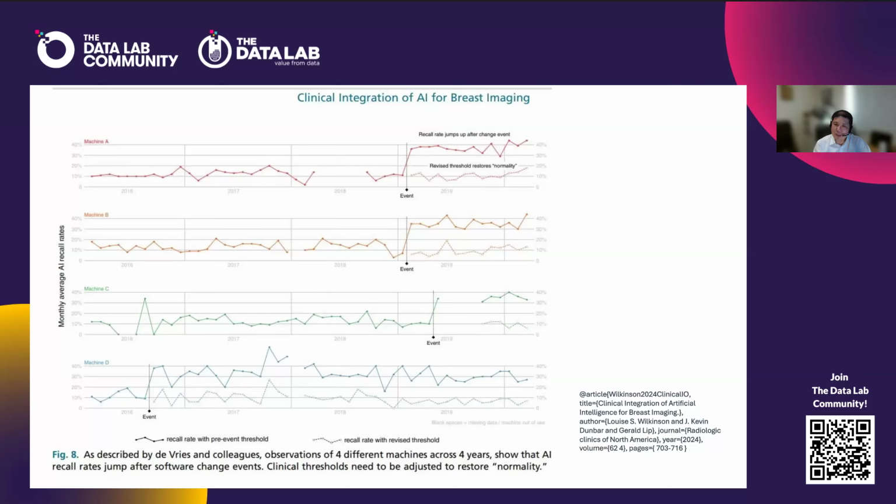And that brings in that whole discussion on post-market surveillance and continuous measuring of the AI performance. You don't want to be installing something in healthcare detecting breast cancer in women in the UK and then have an unexpected change in its performance. So we have to have ways of measuring, because once we deploy AI at scale, it's going to be deployed at large numbers. It's not going to be one rogue clinician or one person who's not doing things right. It will be an AI at scale that might change.